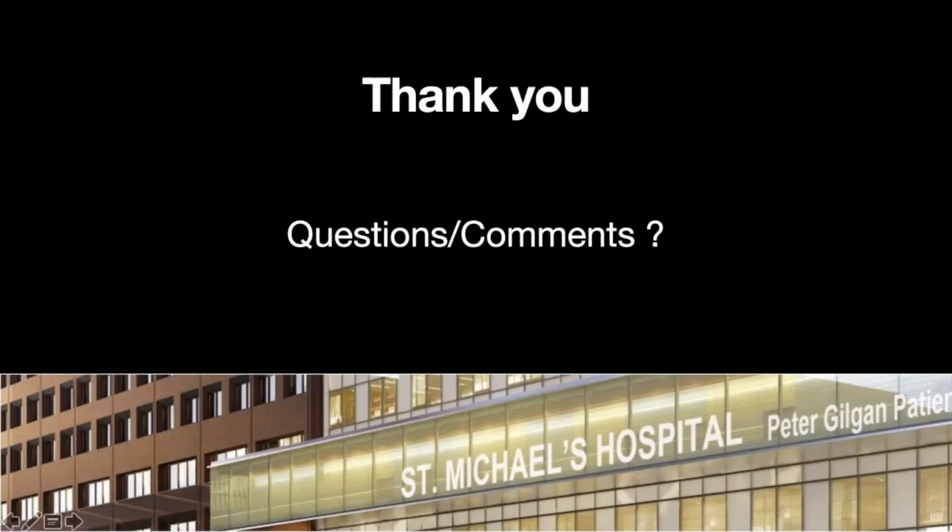So great talk, Nick. And I think all of the important points have been made. I guess maybe a comment. One of the problems with aortic stenosis in the echo lab is the follow-up.